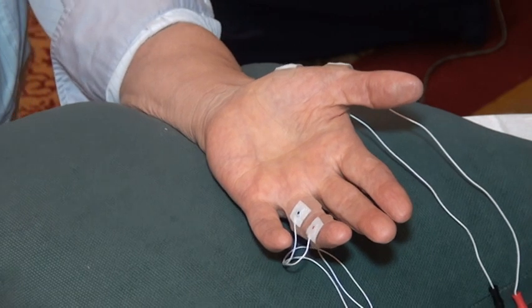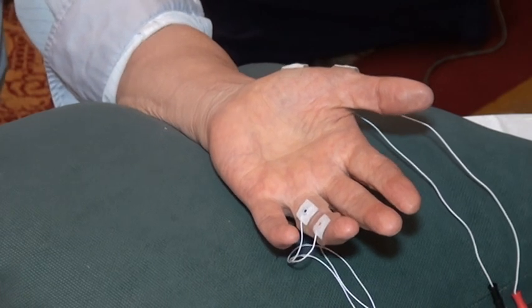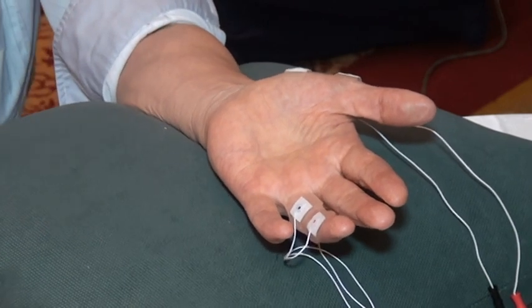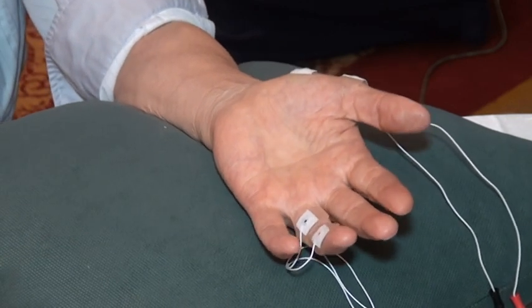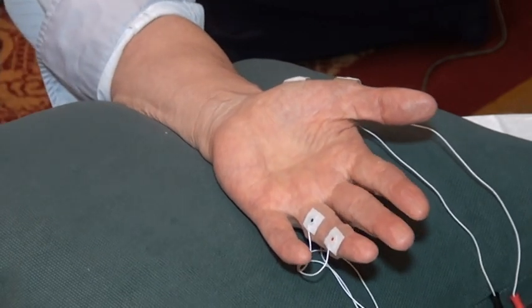And if there is a latency increase of more than 0.5 millisecond, that's always abnormal, right? If median latency is greater than ulnar latency by 0.5 millisecond. And sometimes you see a 2 millisecond difference, huge difference. So that's one thing we do. We always try to compare one nerve to the other nerve, which is a good way to do it, right?